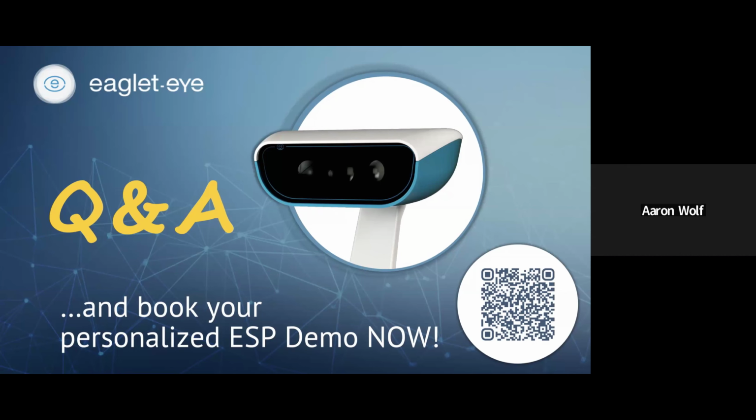Yeah, that's a good question. A lot of it just depends on how good a vision you can get with the simplest approach, right? How good a vision can you get with glasses? That's not very good. What could you get with a soft lens? That's probably not very good with keratoconus. And then you just kind of move up from there. It also depends on how happy or satisfied they are with slightly reduced vision.